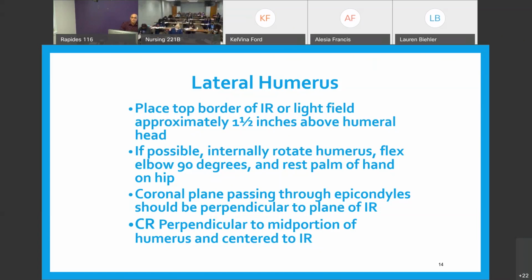If the patient's holding that arm, and it even tells you about that, it says if the patient is not already holding the hand of the broken arm, have them do so. That's on the third bullet, second bullet underneath the position of part. So they're saying if they're holding their hand, they know they have a broken arm, holding it, you can actually shoot them from the back and get the same image. Okay? And they can continue to hold their arm.